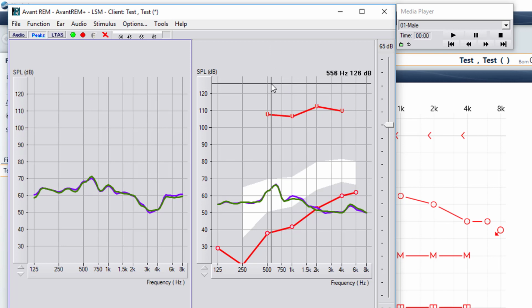And so basically what this is for, when you have so much hardware around the ear, so you have the hearing aid, the probe mic, and an open dome. When that calibration signal comes out, it's being amplified by the hearing aid, going into the ear, bouncing off of the eardrum, and coming back out. And since that reference mic and the hearing aid is so close, it can create a feedback loop, which this open fit function is eliminating that possibility.